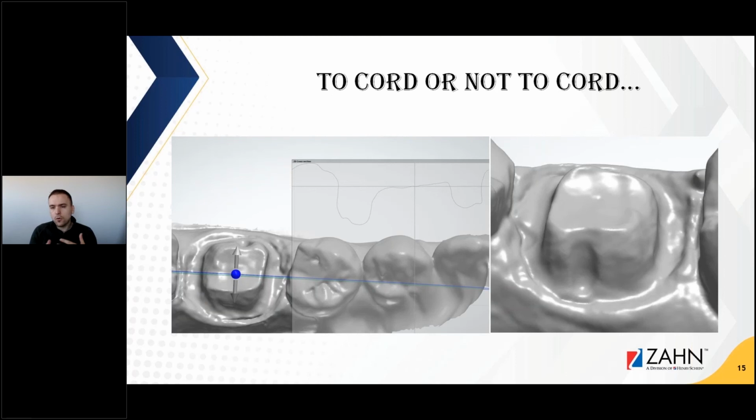And so what you look for is little markers, shadows, you can move them around. But basically, to accentuate this image here on a 2D cross section, this is the area that's the biggest problem.